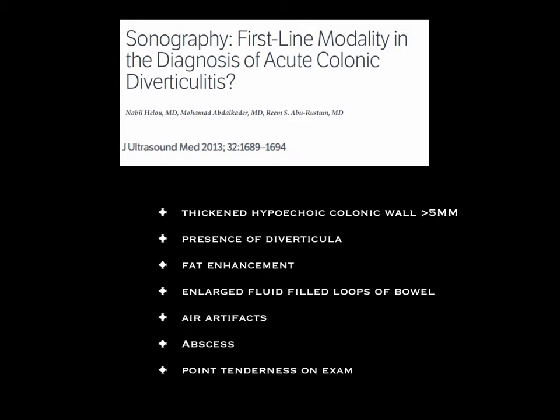You may be able to visualize diverticuli or air artifacts that suggest diverticuli, but these may be best visualized with a high-frequency linear probe. And then we can also assess for point tenderness on exam with compression of the probe, which may suggest the pathology that lies underneath.